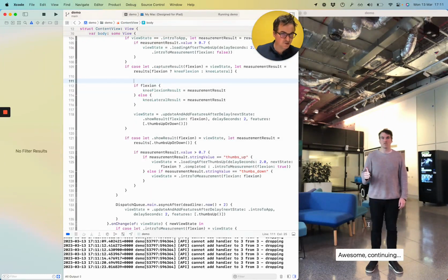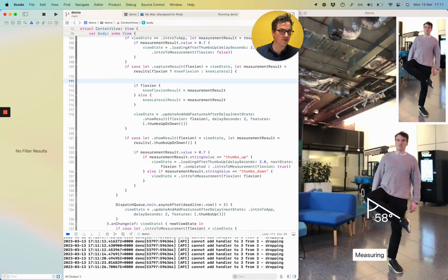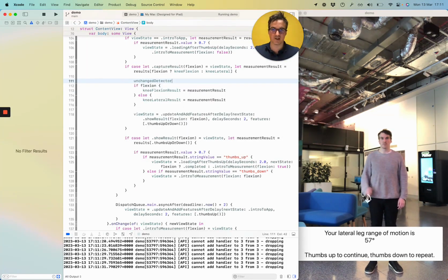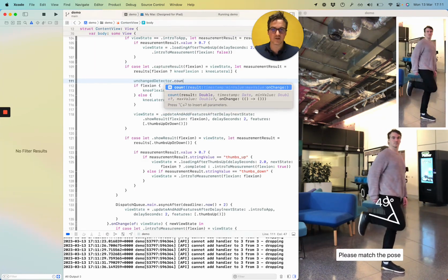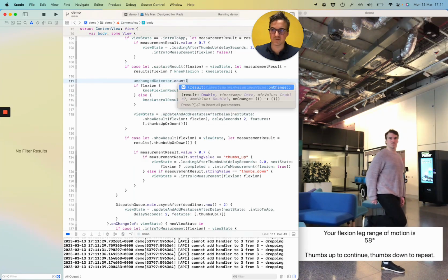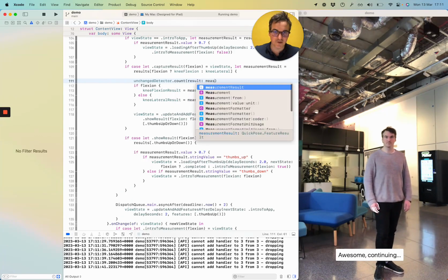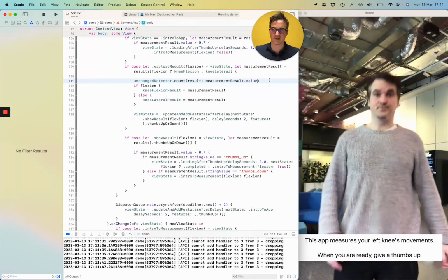So let's just sort of make a little mental record of the numbers I'm getting. So it's around 58 here, 57. So with an unchanged detector, I'd expect that value to be a bit smoother. So it takes in a result, and here I'm going to pass it the measurement result. And it takes in a double, because I've specified a double version.